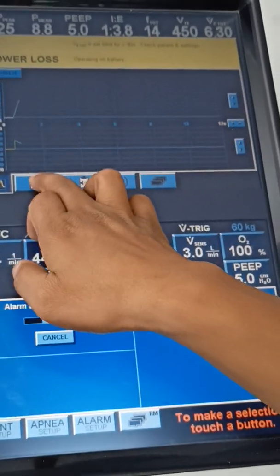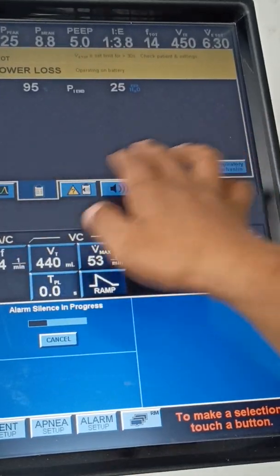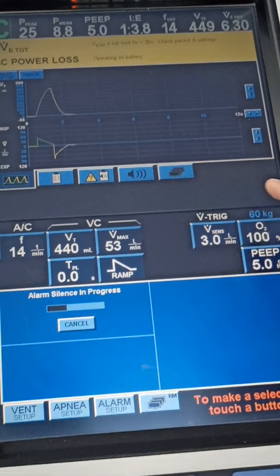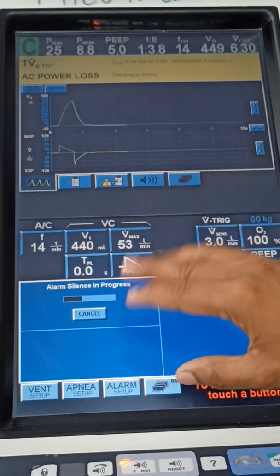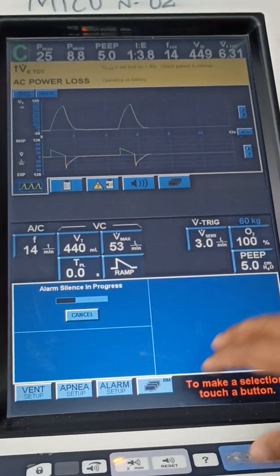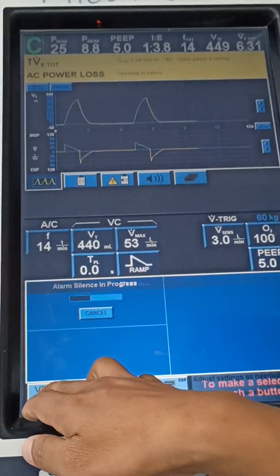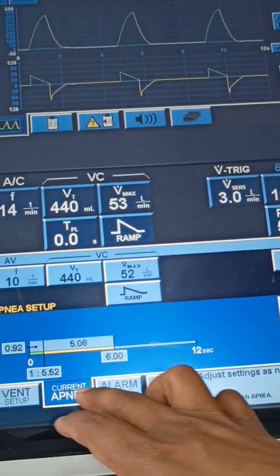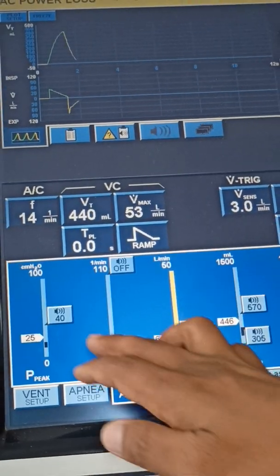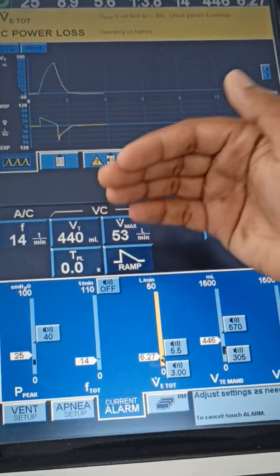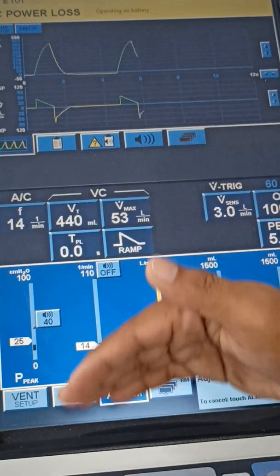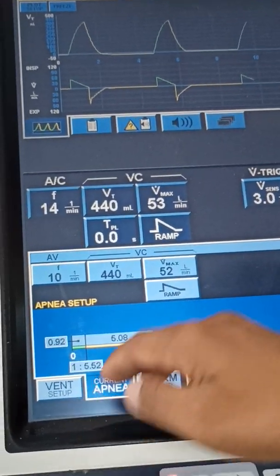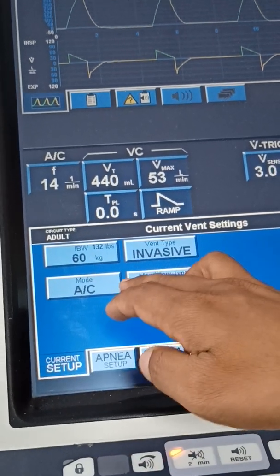These are the patient values you can see in a graphical way, and also in text form. On the bottom, you will see ventilator setup, apnea setup, and alarm setup options. In alarm setup you can set the top-end and low-end values for alarms. In apnea setup you can also configure settings.